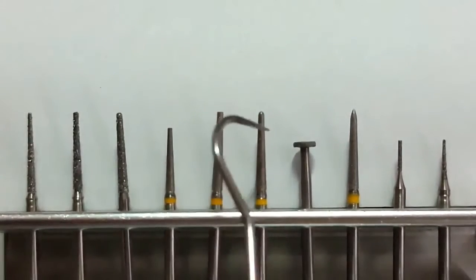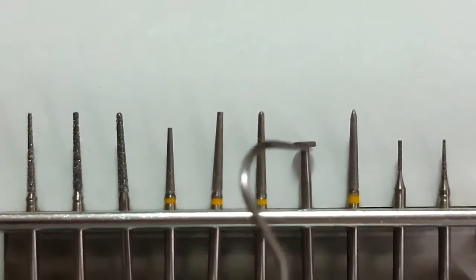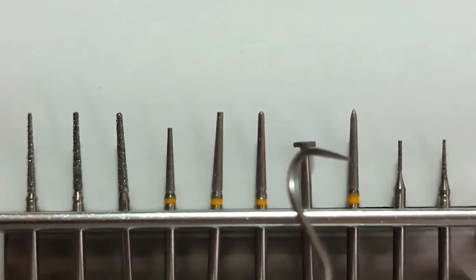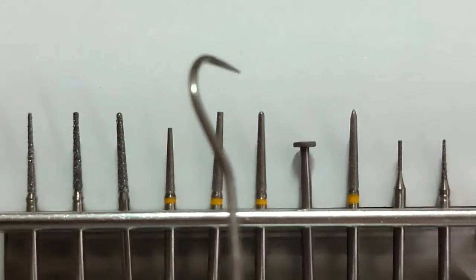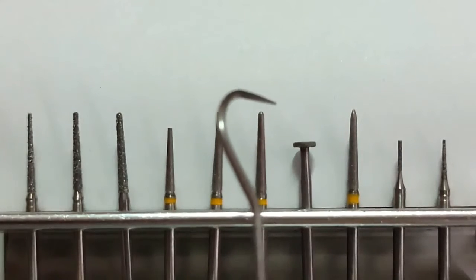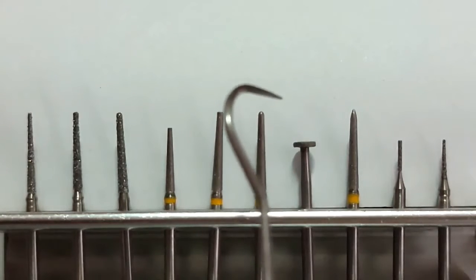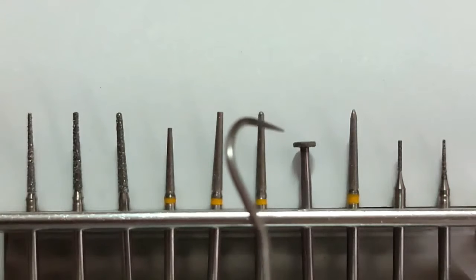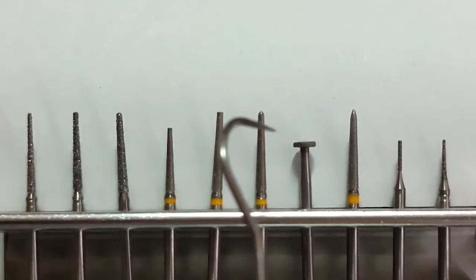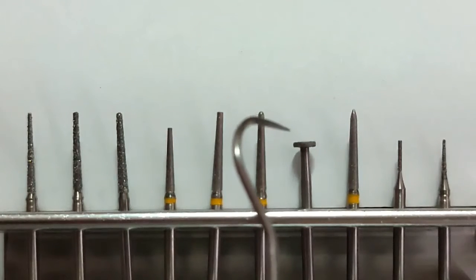So, dito naman, when you go to your occlusal, it's any burr na you can easily control kasi siyempre ang daming slopes. So, for general occlusal reduction, I use a wheel burr and then reduce 1.5mm on all cusps first. Not exactly at 1.5mm, siguro mga nasa 1.3mm, so short of 1.5mm para may allowance pa ako to do the occlusal anatomy.